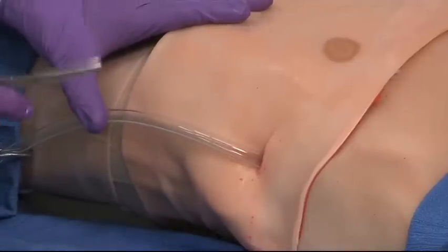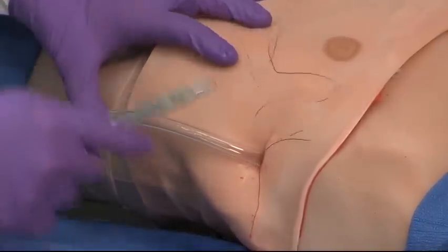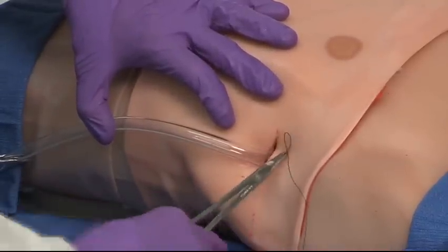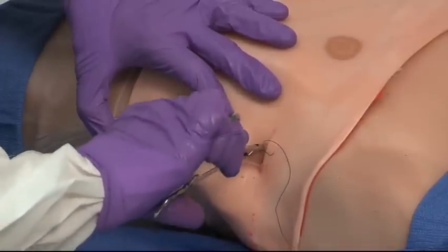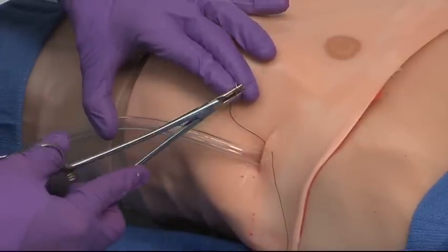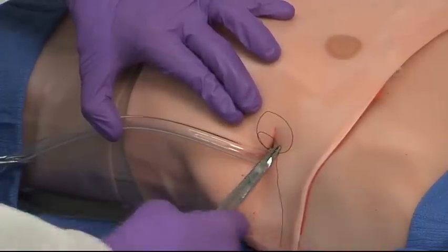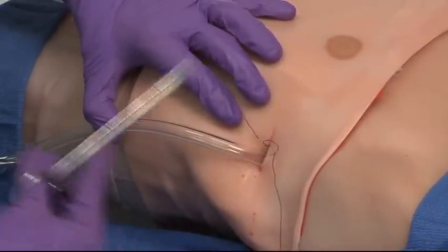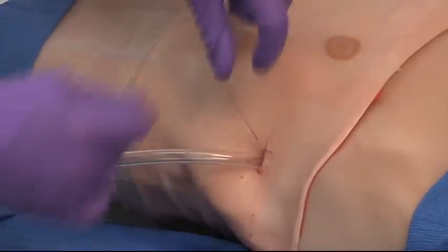Now that the chest tube's in place, we're going to go ahead and sew it in. Generally, you want to use at least an O silk. You're going to create a suture on either side of the incision. Taking a nice generous bite. The goal here is you're going to want to secure this tube in place so it doesn't get pulled out, particularly if this patient is going to be transferred somewhere else. You want to make sure you secure it firmly. So we're going to tie this down.